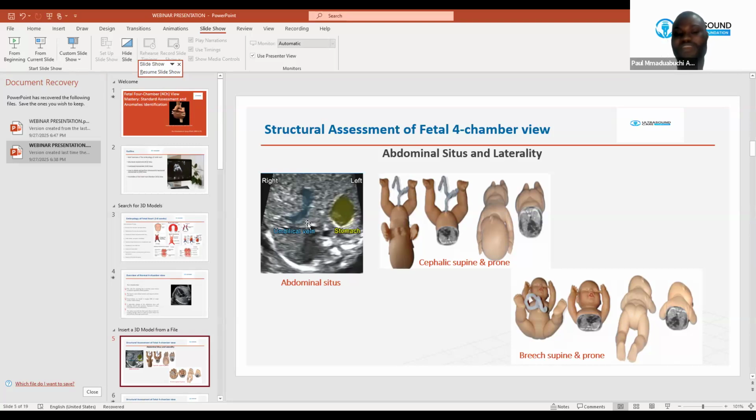This is the stomach and this is the umbilical vein moving away from it. So this shows you that this is a left umbilical vein. However, when the umbilical vein is moving towards the stomach, you know that it is a persistent right umbilical vein. So please, Lashell and Dr. Mu could also add something to it, please.